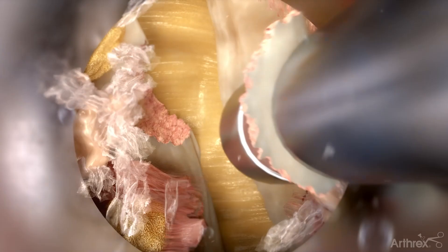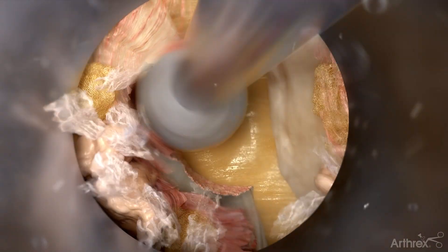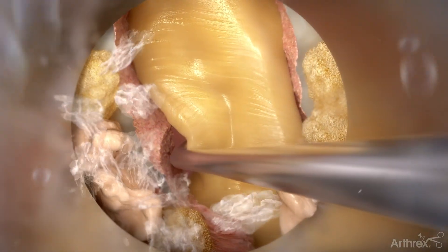Kerrison punches and burrs can be utilized to undercut the lamina. Continue the laminotomy on the contralateral side, exposing more of the ligamentum flavum. Begin to detach the ligamentum flavum and ensure there are no adhesions to the dura.